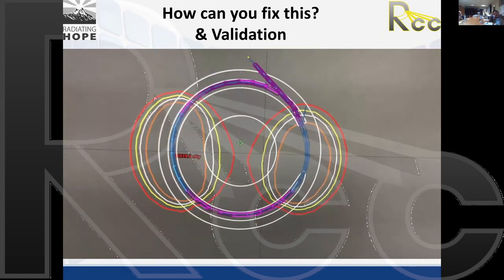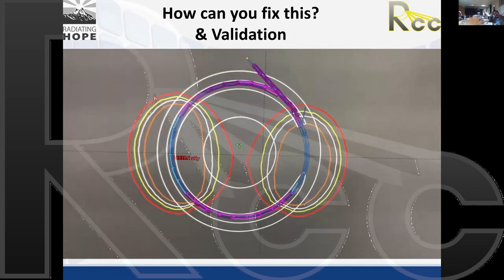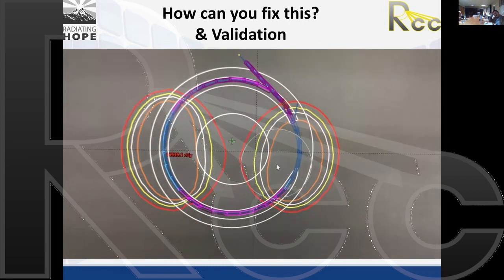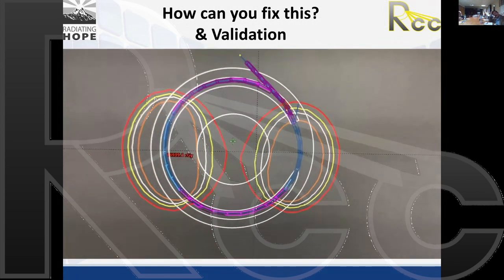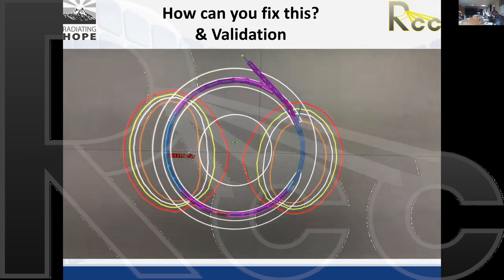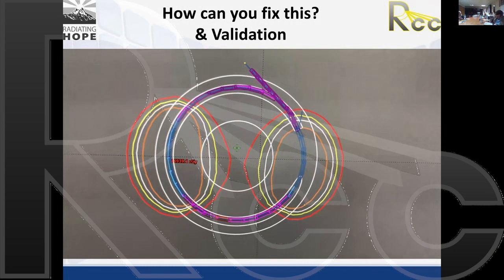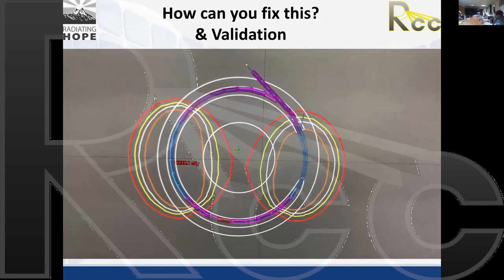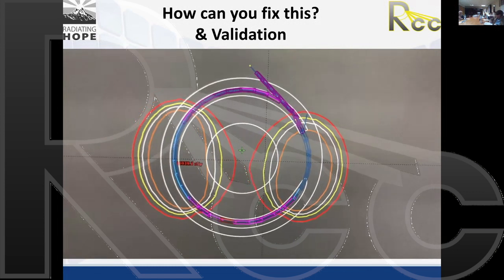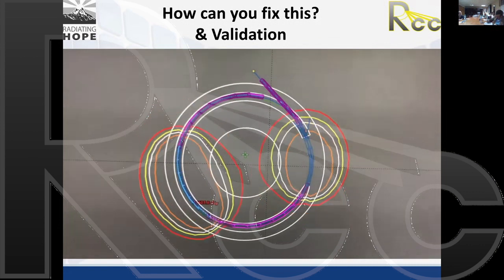So the first option is to do a dosimetry plan, which looks like we want it, and then to copy and paste the plan, make it a delivery plan, shift the dwell positions away from the distal end by the offset determined in commissioning. So a new delivery plan looks like this, but it delivers inside the patient like this.